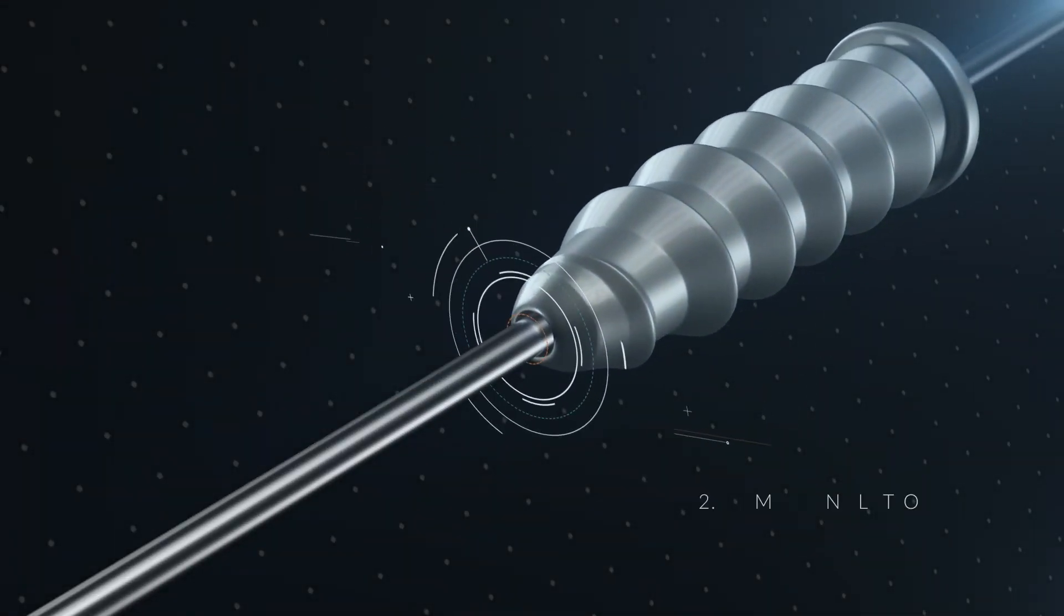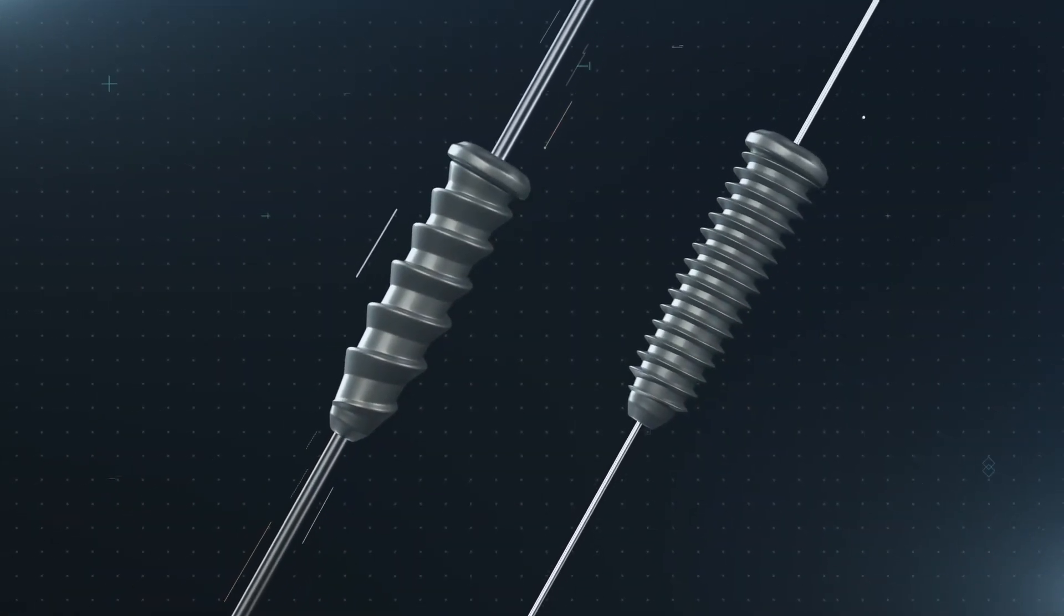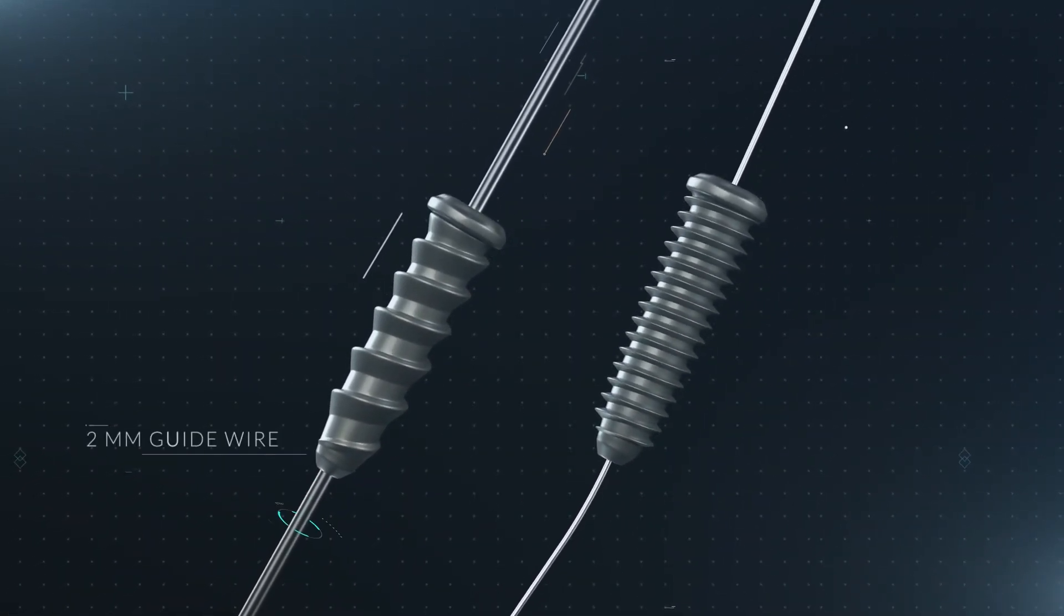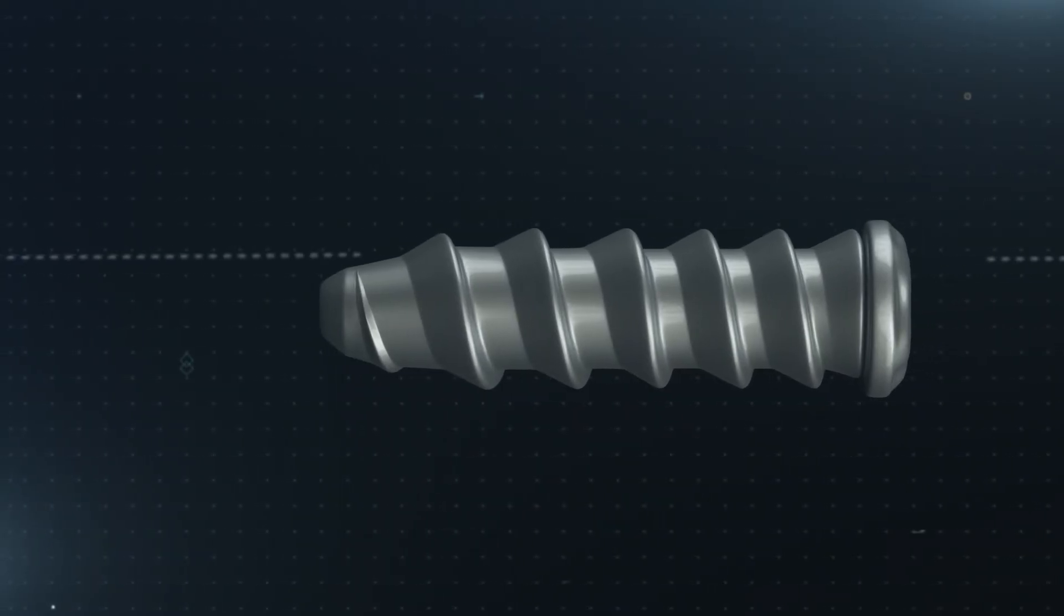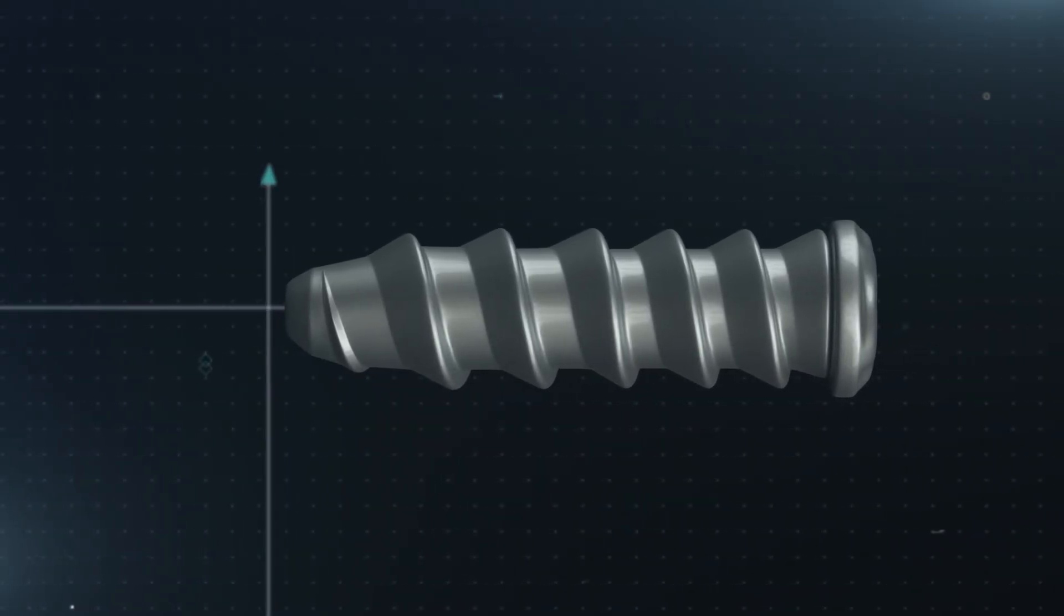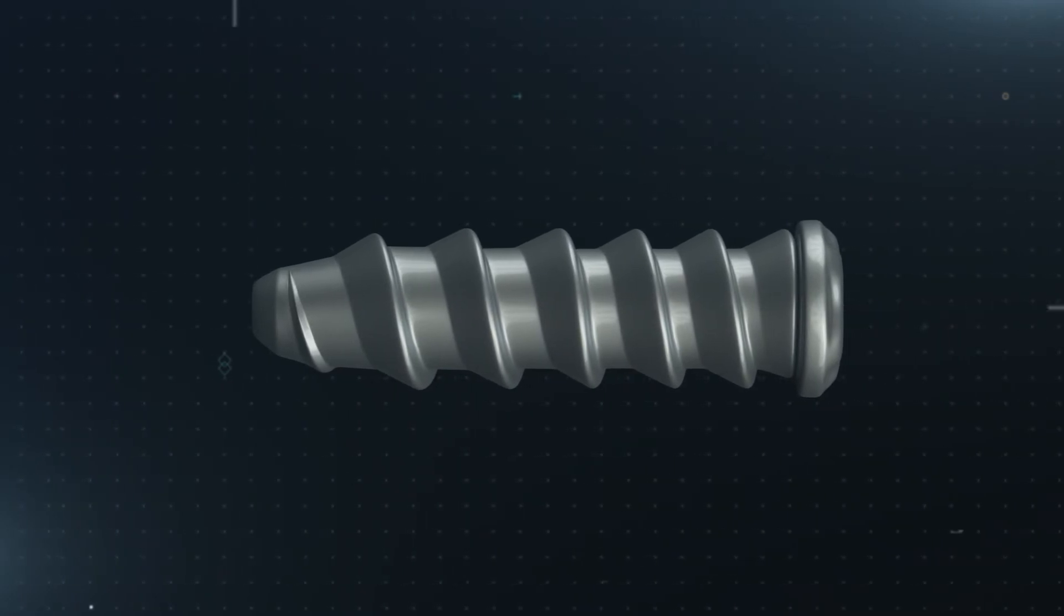The screw features a wider 2.5 mm cannulation, so a rigid guide wire can be used. And with the addition of a tapered tip, smooth entry and correct angulation is achieved with minimal effort.